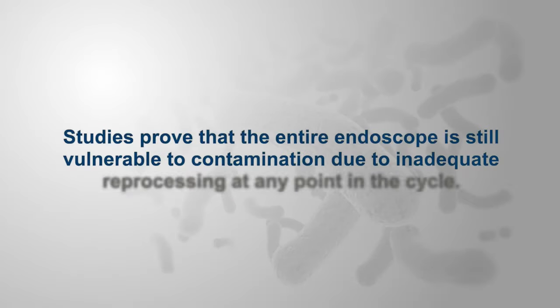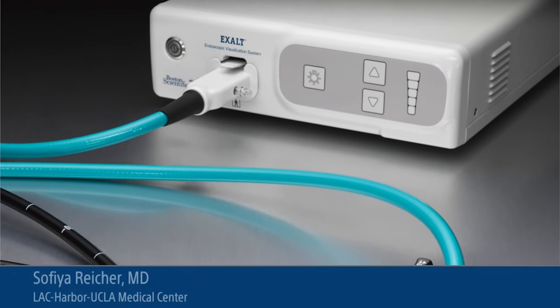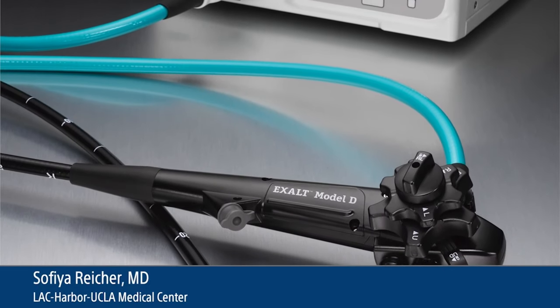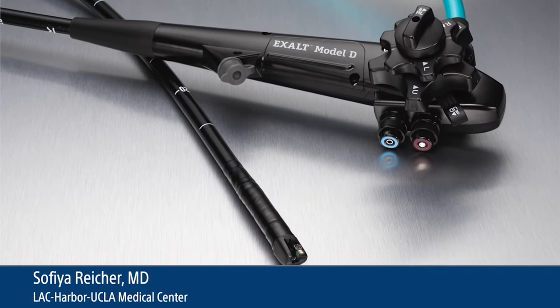Disposable tips of scopes will help, but it's not the long-term answer. Either the reusable scopes have to come out as something better, where complete sterilization is actually possible, or I think the future is going to lie with disposable scopes. Clearly, where the field is going is towards the use of single-use devices. And the more we try and the more we get familiar with it, it's going to be a game changer for the field of interventional endoscopy.